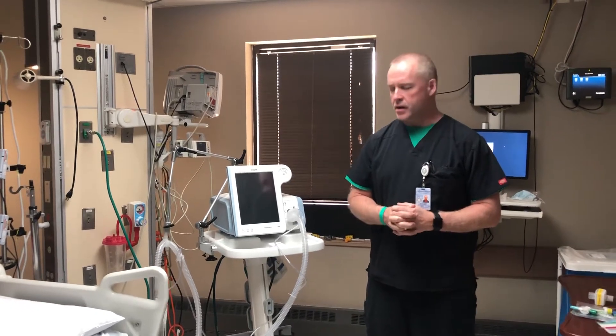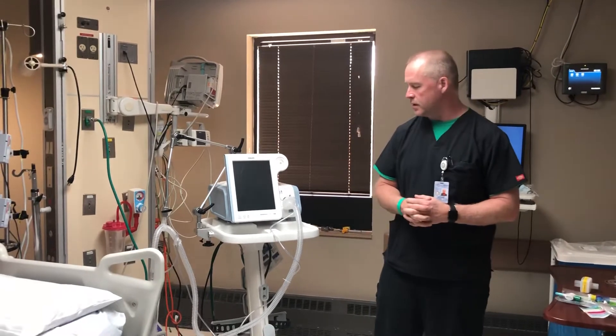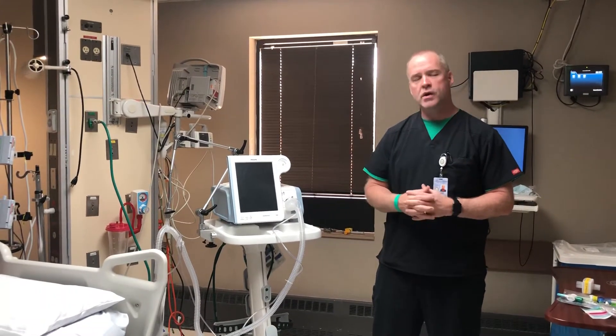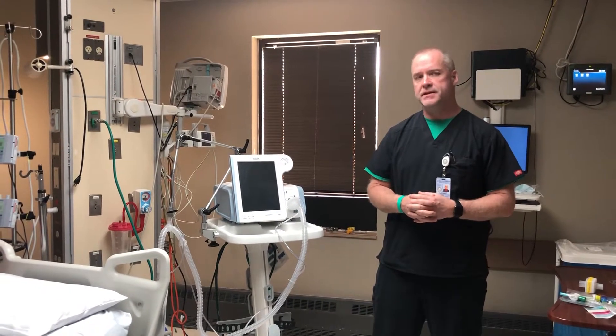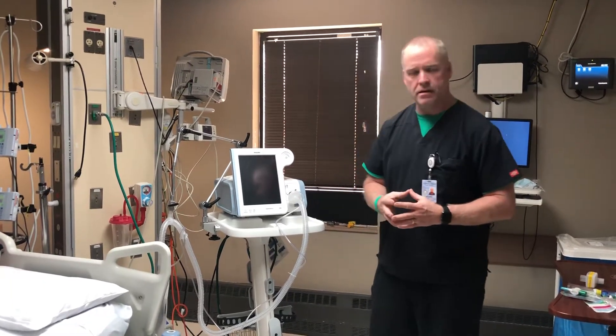Hi guys, my name is Richard. I'm the Cardell Pulmonary Director for Cherry Connection, WWH's Hospital here in Tahlequah. I'm going to give you a quick overview of the Philips Respironics V60 BiPAP CPAP machine.